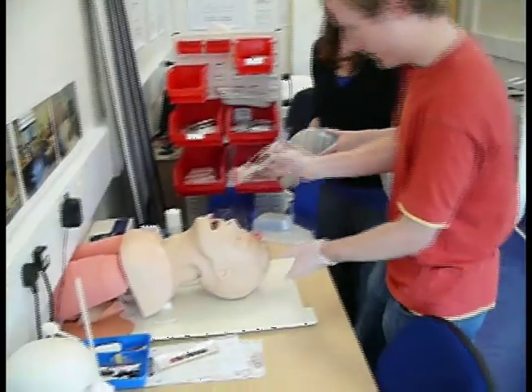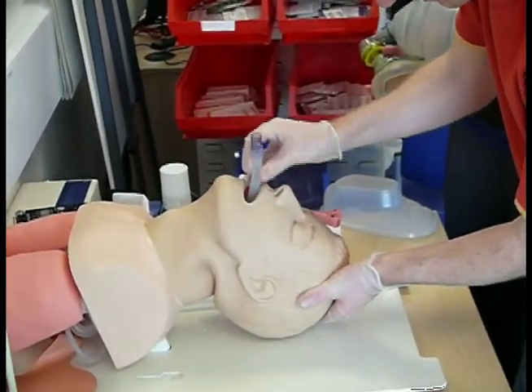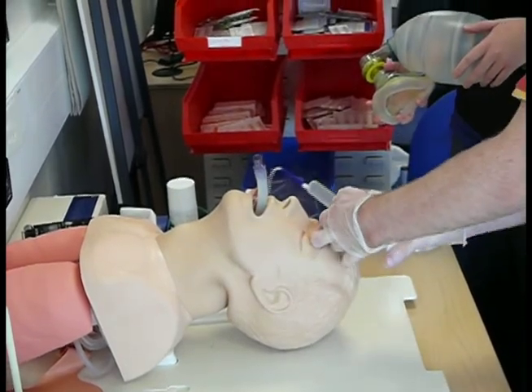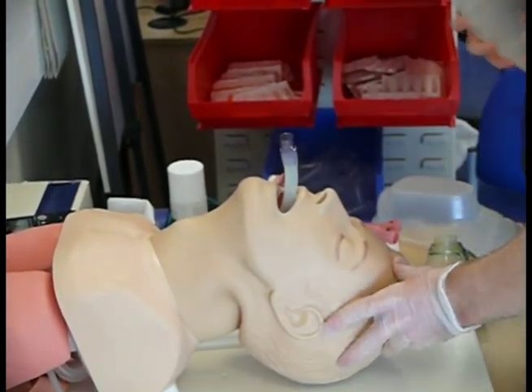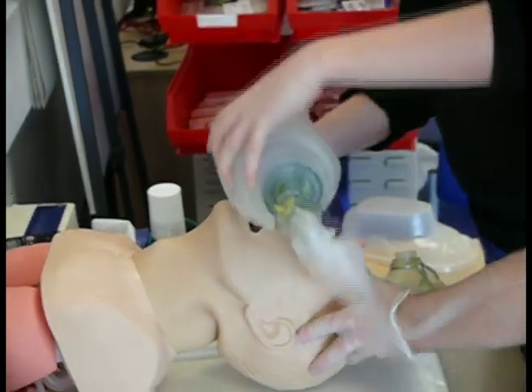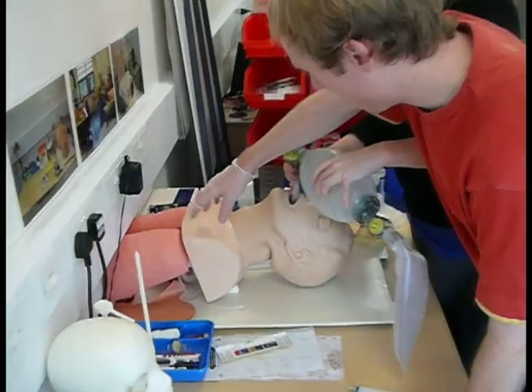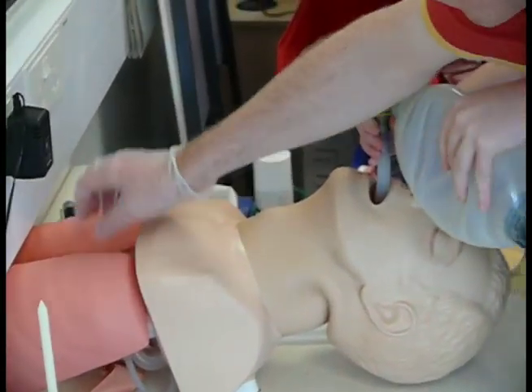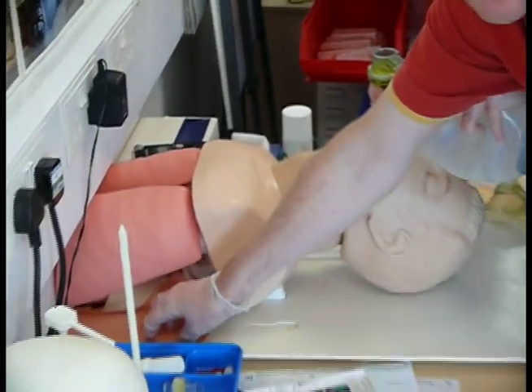Let's get this out of the way now. Then I'm going to check for air entry by looking at the chest and auscultating with a stethoscope the lung fields, and auscultating the stomach to check that there's no air going into the stomach.